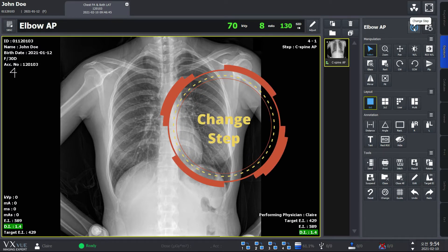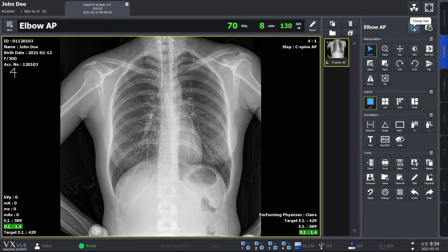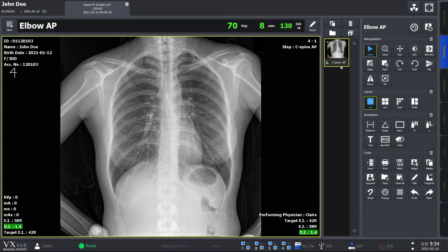First, Change Step. As the name implies, Change Step allows you to change the step information you're currently working on. You might need this function when you have simply entered the wrong information. For example, you'll see that the thumbnail indicates a different body part from the x-ray image.